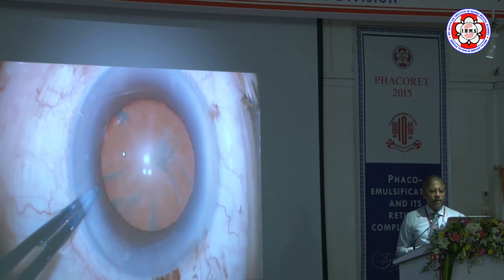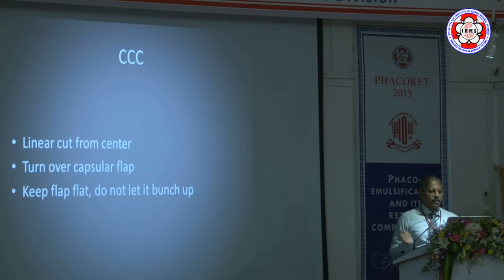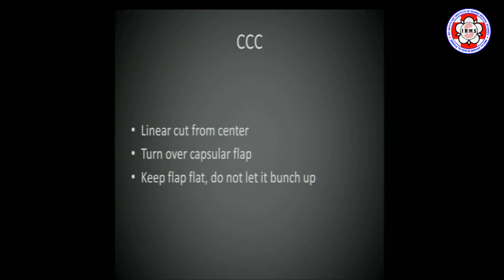And there you have a very predictable result. A linear cut from center — the cut can travel downwards, upwards, to the right or left, that's a personal choice. Turn the capsular flap over, flatten it, turn it round, go circular, don't let it bunch up. If you're doing it through the side port, the chances that viscoelastic will leak out are much less than through the main port. With experience you can learn to do the main port. If you use a rhexis forceps, it's a larger instrument requiring the main port, increasing the chance of a shallow chamber. Micro-rhexis forceps are available that go through a 1 mm side port — try using them, they are very good.